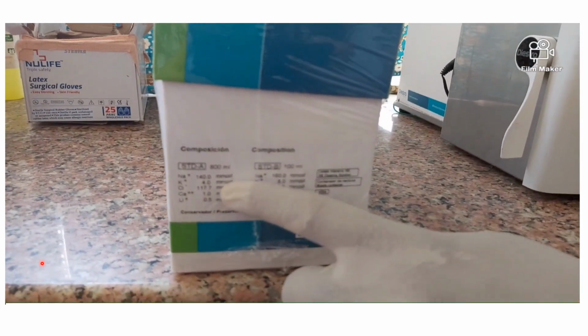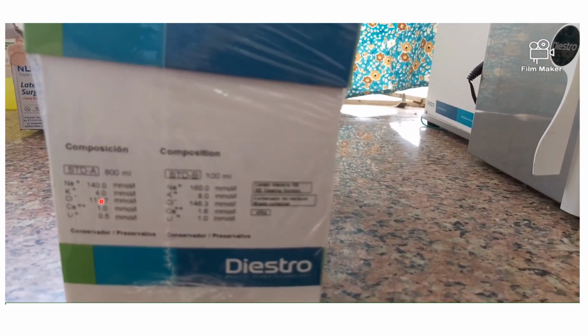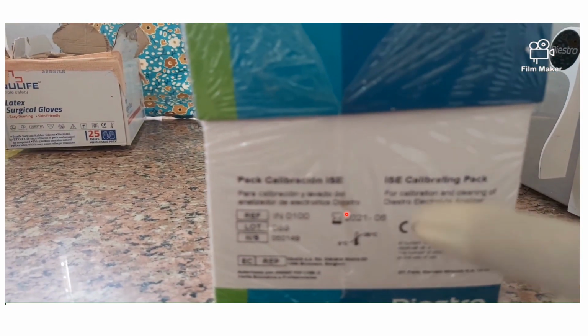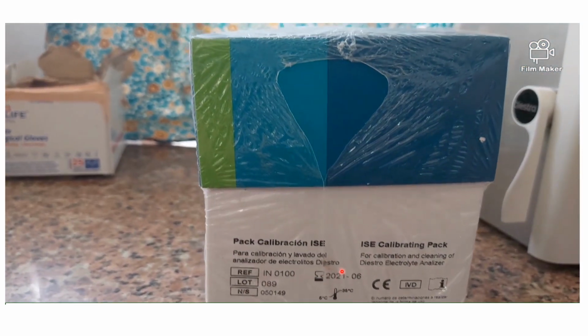Now this is a sodium potassium electrolyte analyzer reagent pack which has reagents for estimating sodium, potassium, chloride, calcium, and on this side the pack details are written such as reference number, lot number, and the expiry date.